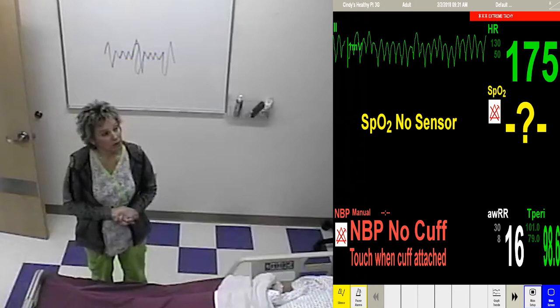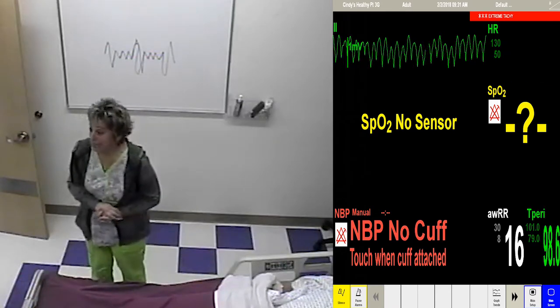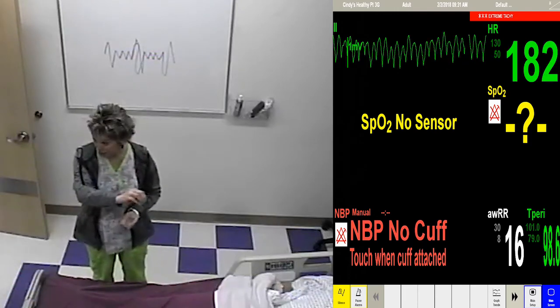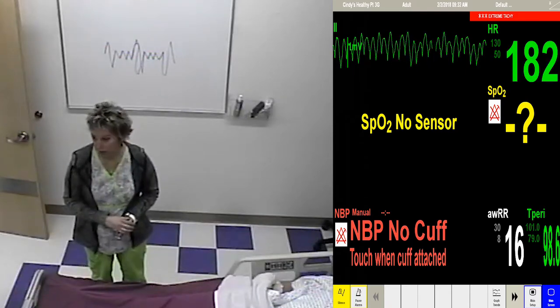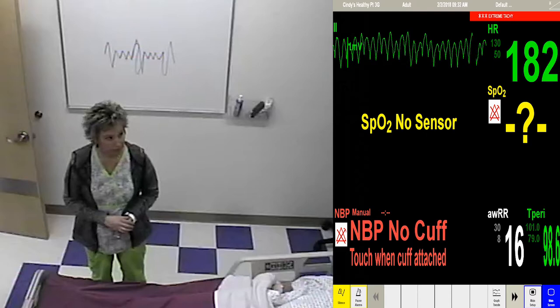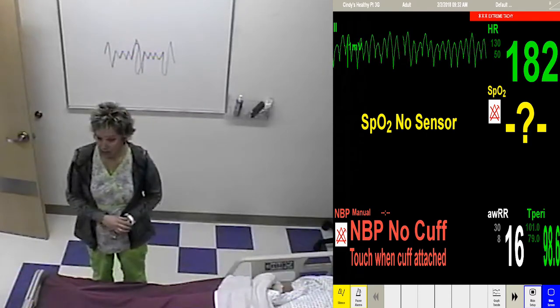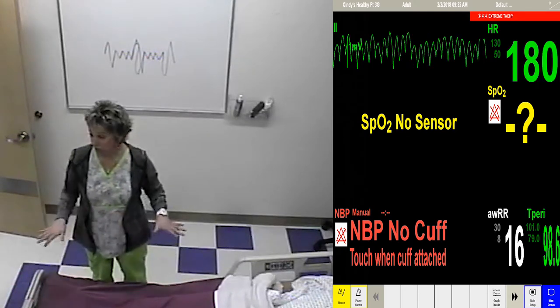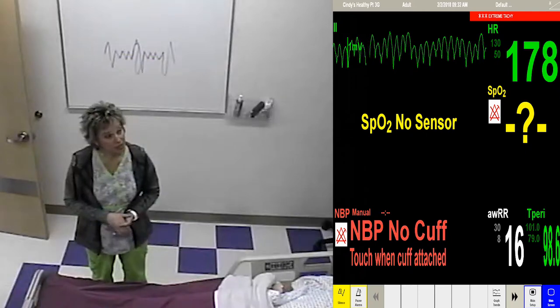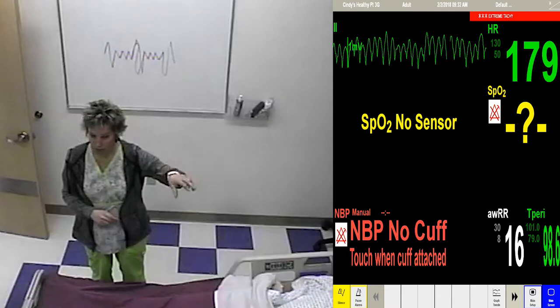Okay. Are there P waves? No. Are there QRS waves? Yes. That's all that is. Are there T waves? No. Is there a P before every QRS? No. Is there a T after every QRS? No. Is it regular? Yes. Did you answer yes to all those questions? No. So is there any way it's sinus? No. So this one is simply, since it's only QRSs, what is this rhythm?